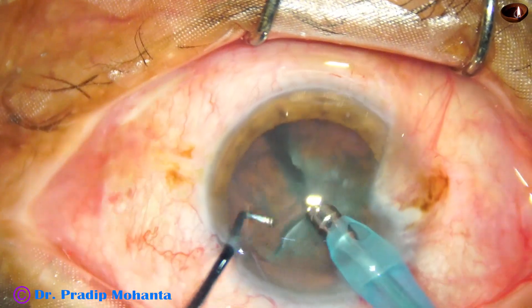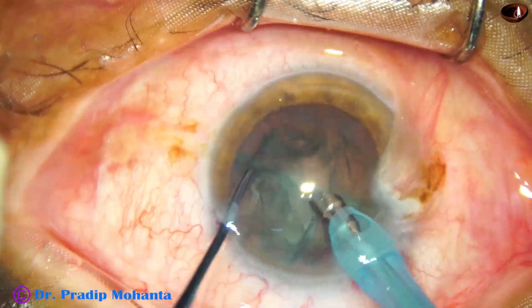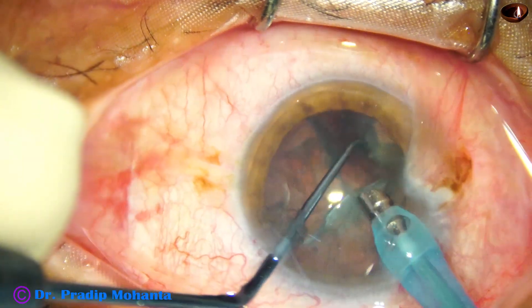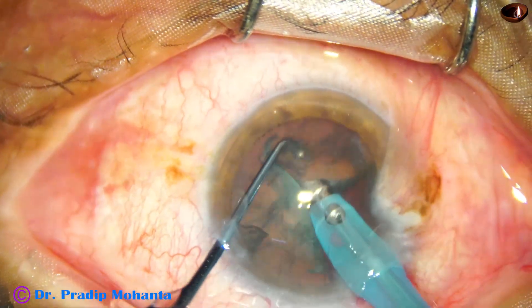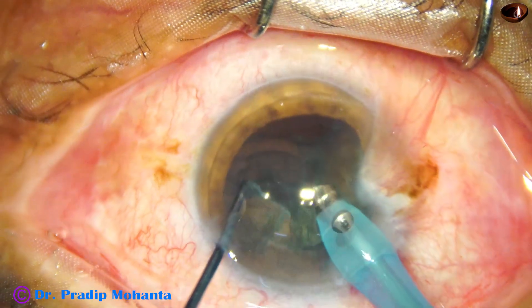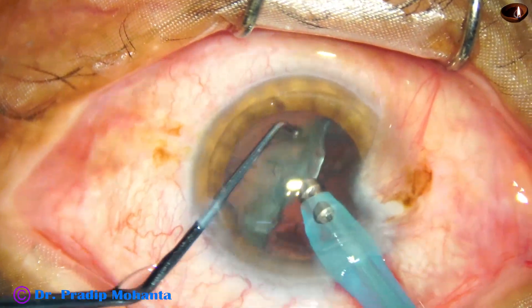Now I take the small nucleus sustainer with a 1.7 millimeter tip length — this is easier to manipulate in the anterior chamber. I am spinning the nucleus a few times, and here comes the first nuclear piece, then the second one, then we come to the hemi-nucleus.